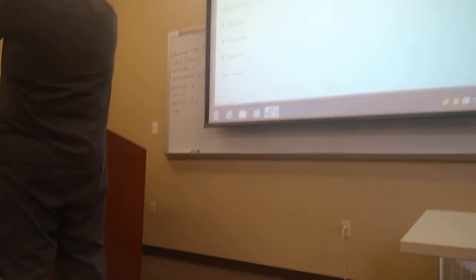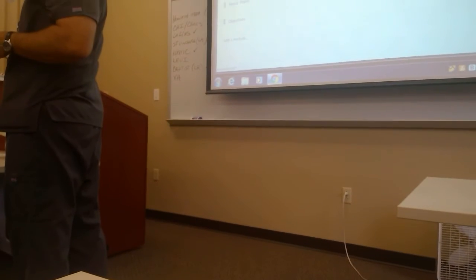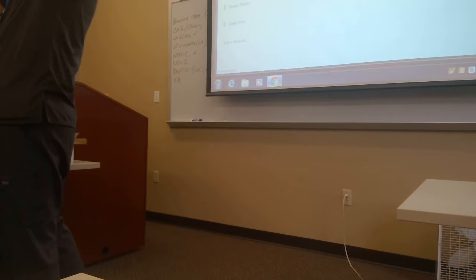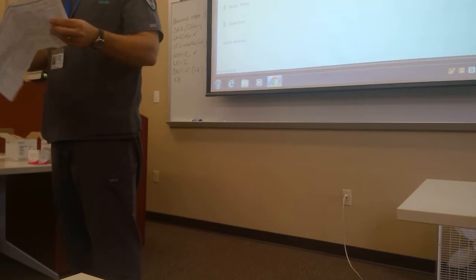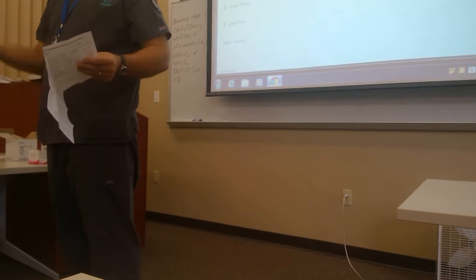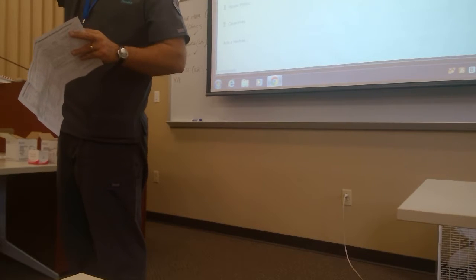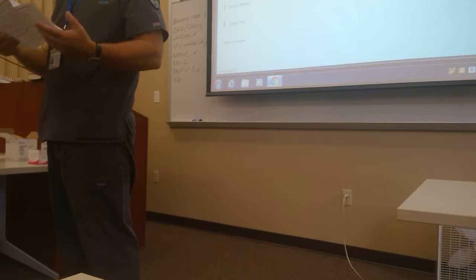It says right here, the pH of this control has to fall between 7 and 8, okay? It says the protein level better fall between 100 and 500 milligrams per deciliter. You see what I mean? It gives you the ranges. You don't have to calculate nothing, but you have to make sure that result falls in between that. If you don't, you have to keep repeating it, and there's a big graph in your book that tells you exactly what you're supposed to do if your controls do not come in range, okay?